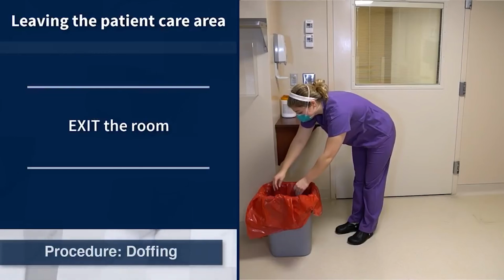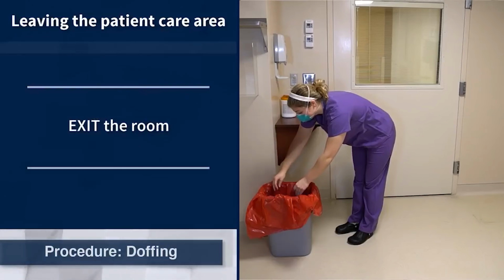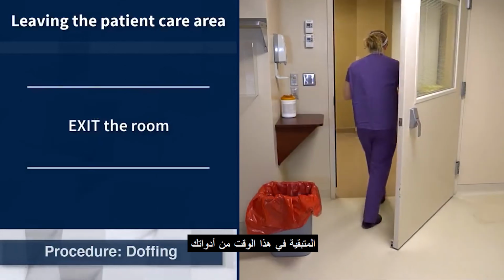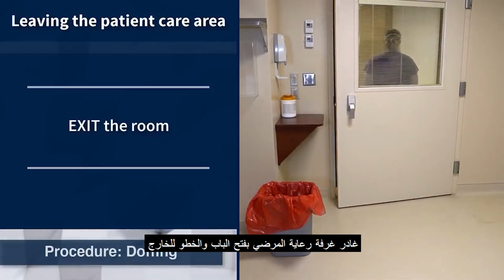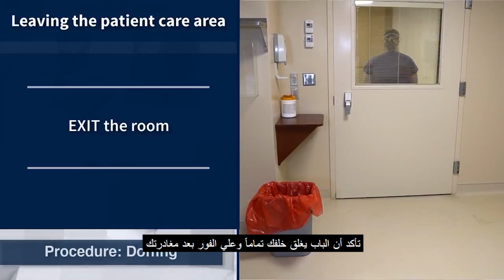The only item of personal protective equipment remaining at this time should be the N95 respirator. Exit the patient care room by opening the door and step out. Ensure the door closes immediately and completely.